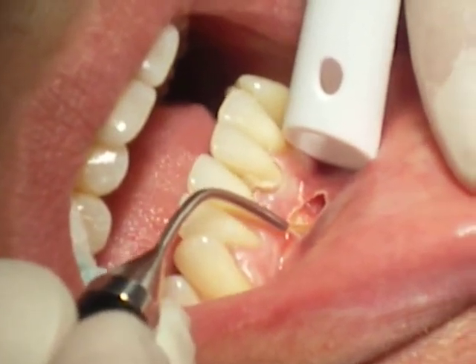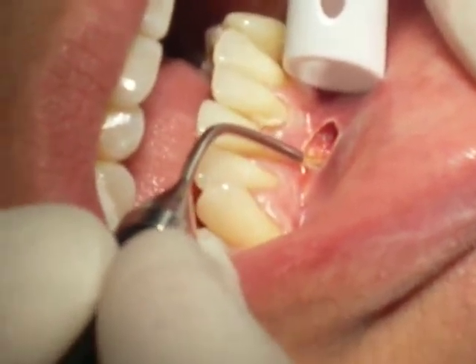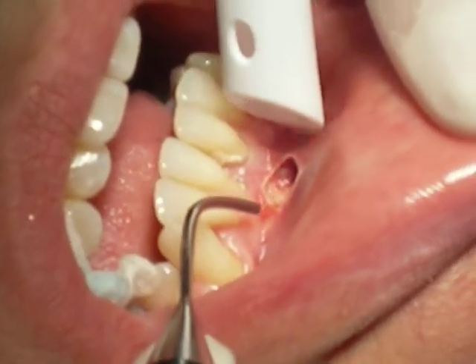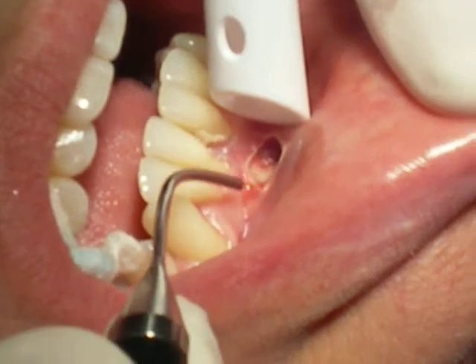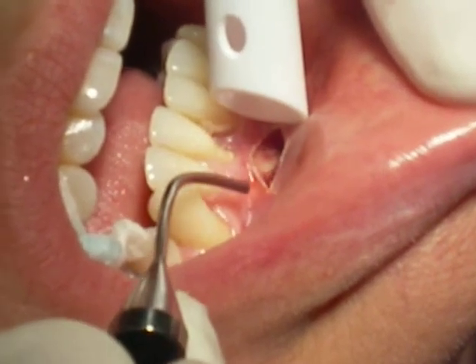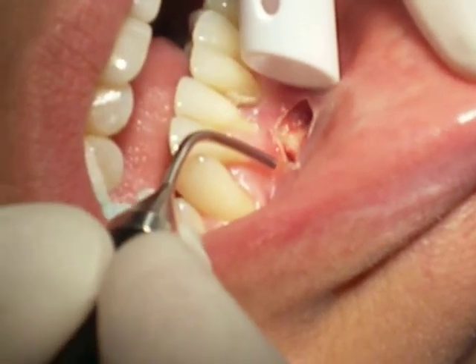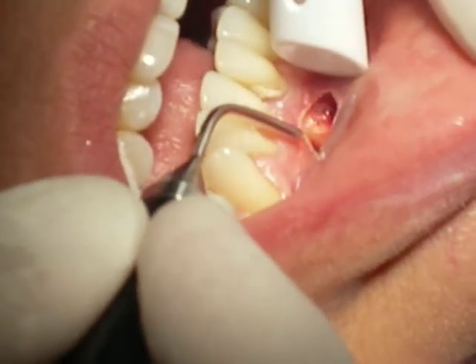You'll notice very little hemorrhaging and good tissue control. The laser works well in these kinds of areas, so no suturing will be required.